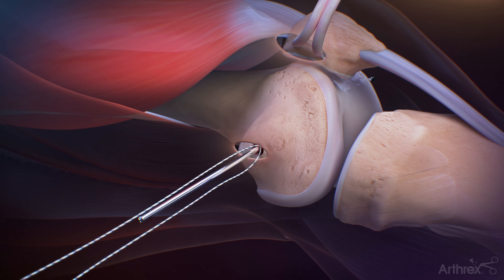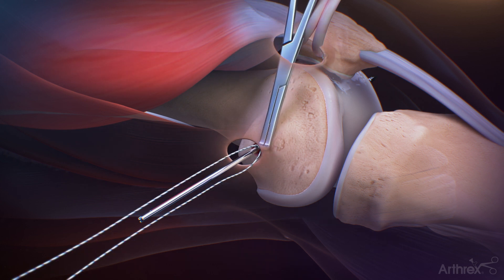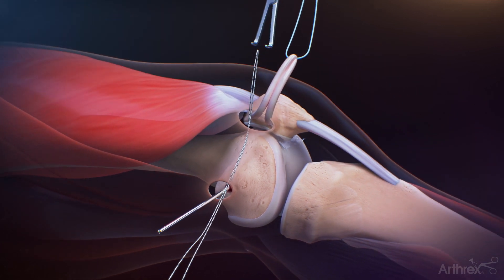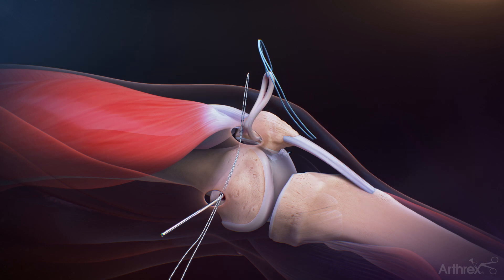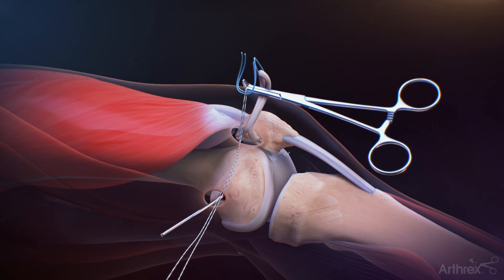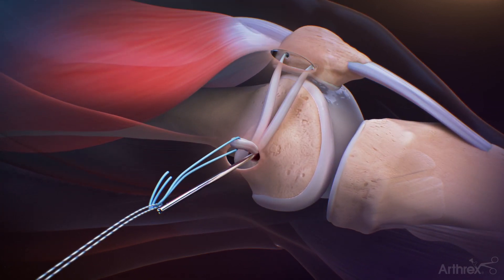The right angled clamp is inserted through the patellar incision and posterior through the femoral incision. Using the right angled clamp, pass a looped No. 2 Tiger Wire shuttle suture to the patellar insertion area. Load the blue No. 2 fiber wire suture into the Tiger Wire shuttle suture loop and pass the sutures from the patellar incision to the medial femoral incision.